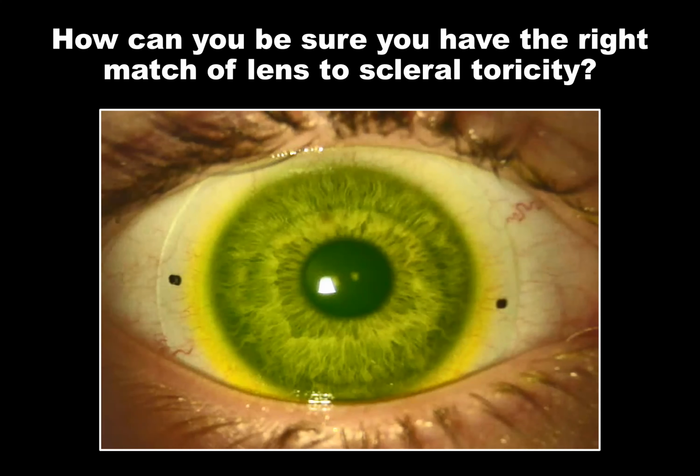If the lens is moving excessively, use the fluorescein test. This tells you whether you have an appropriate landing on the eye surface. Felipe, was that the answer? Did I answer the question?